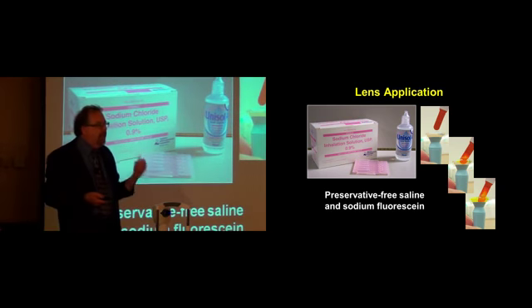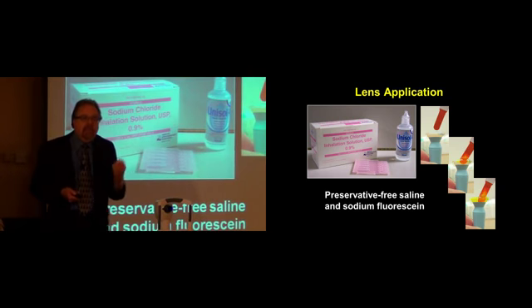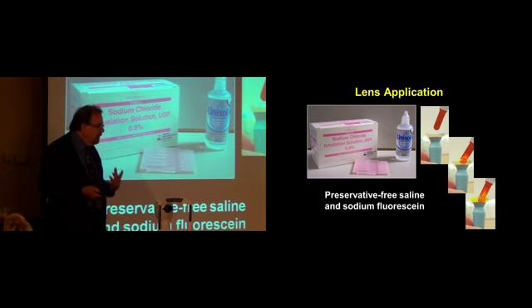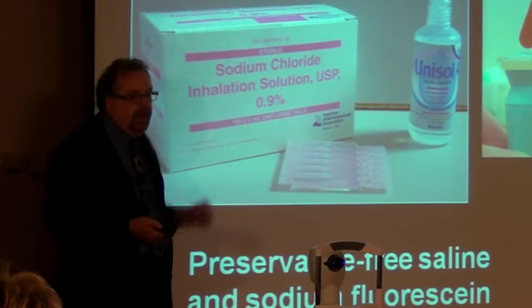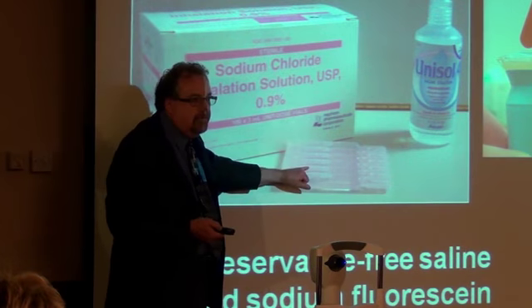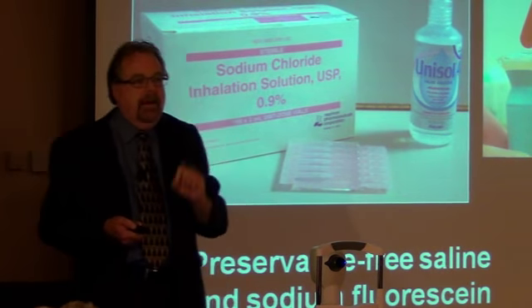It's used for patients in their apparatus at night that have sleep apnea, and they add this saline solution to provide additional moisture for their lungs. But it works really well beneath a scleral contact lens because it's in a unit dose container. However, you've got to be a little bit careful.